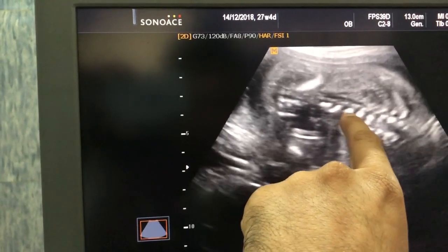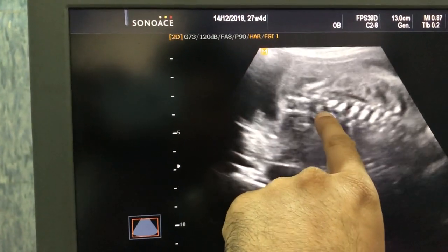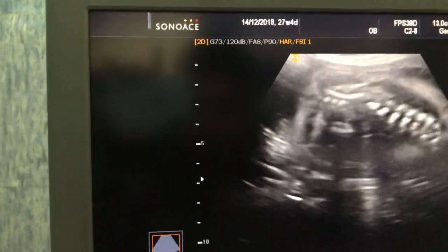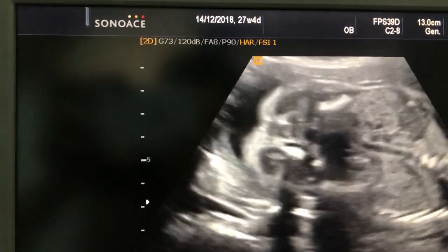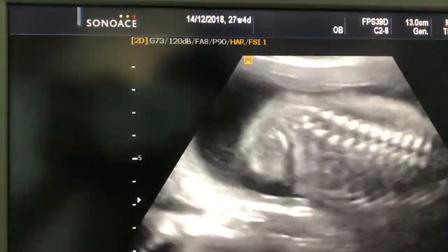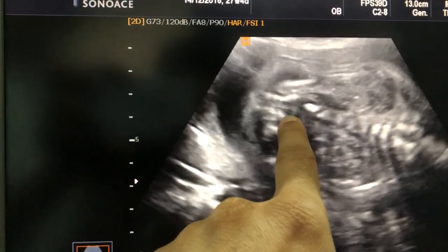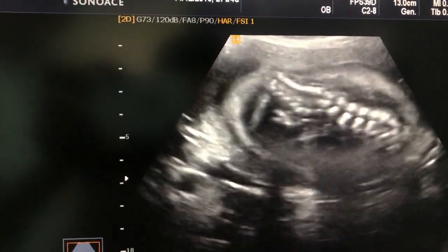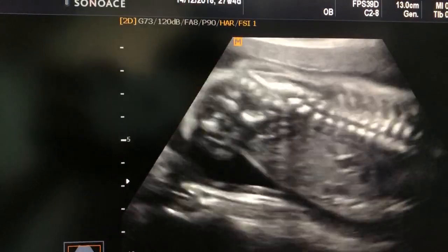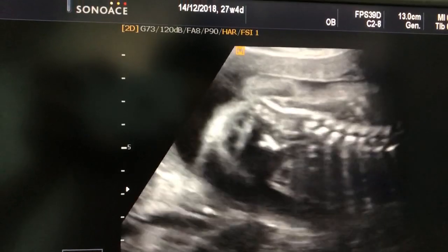This is the vertebral spine in the midline, and there is a defect over here, round structure. This is a closed spina bifida case here, and there is fusiform dilatation of the spinal canal here, very clearly. You can see the spinal elements are missing in the posterior part.